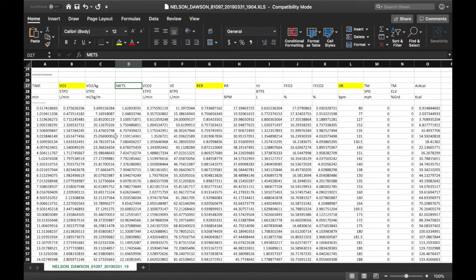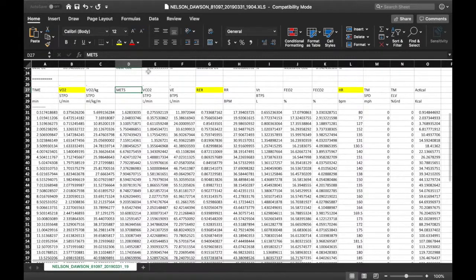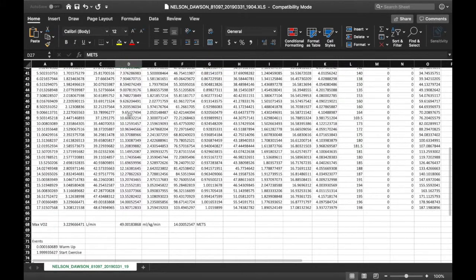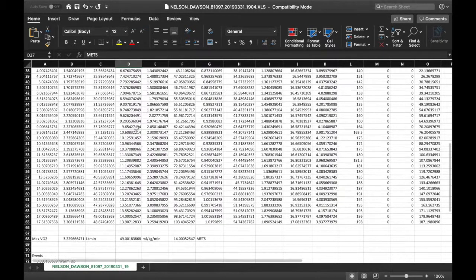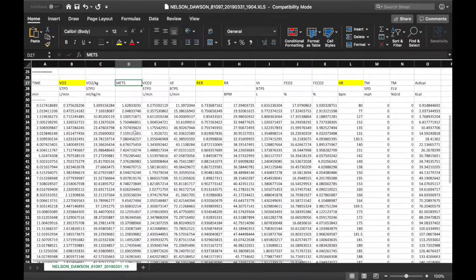Next is METs. METs is really cool because a lot of ellipticals, treadmills, and different machines at the gym will actually have a MET calculator on the display. So if you do a VO2 max test on a client and want to prescribe a level of intensity for them to work at, METs is a really good way to do that. Heart rate would also be a good way to prescribe intensity.